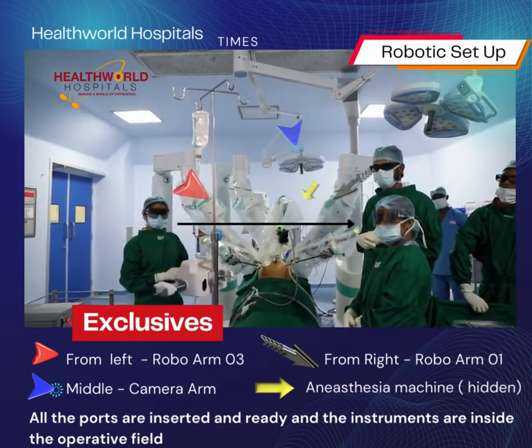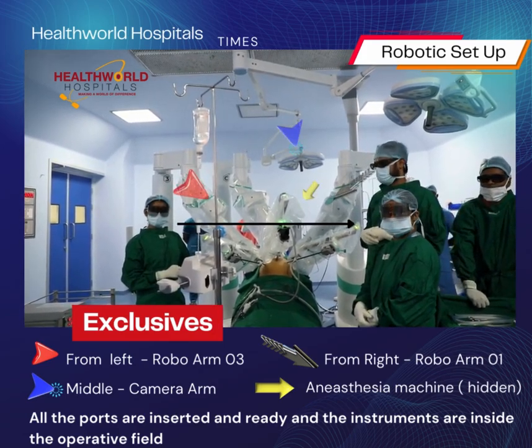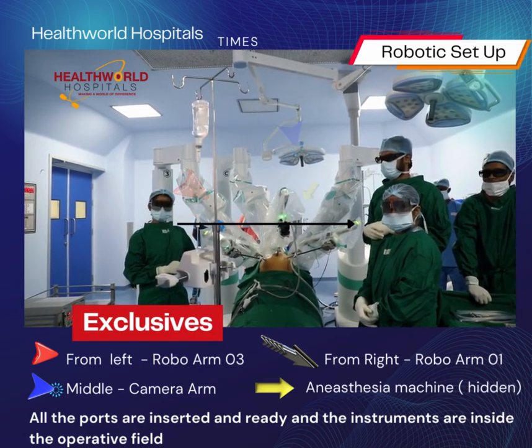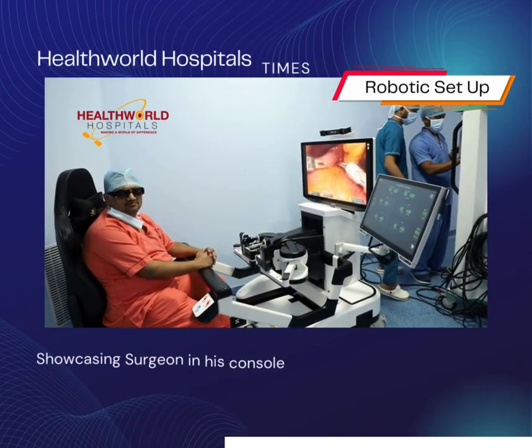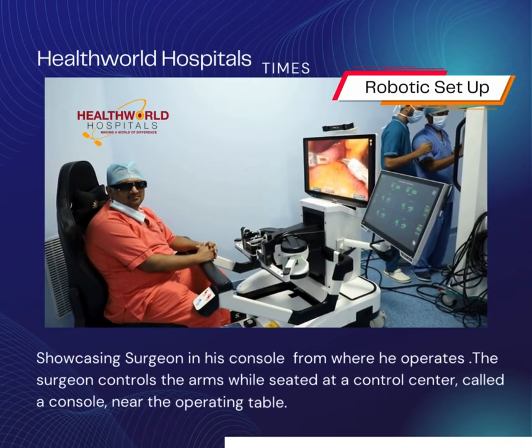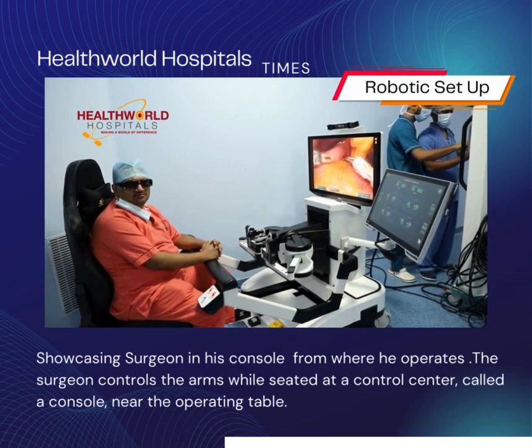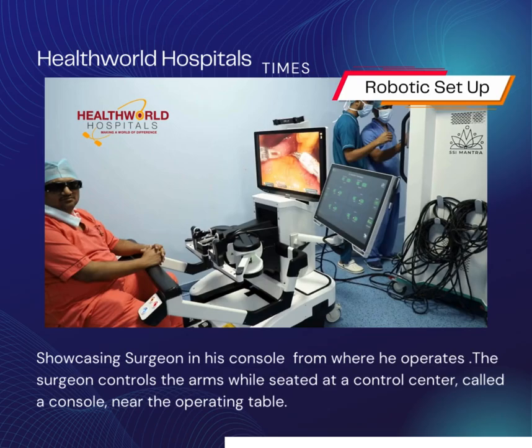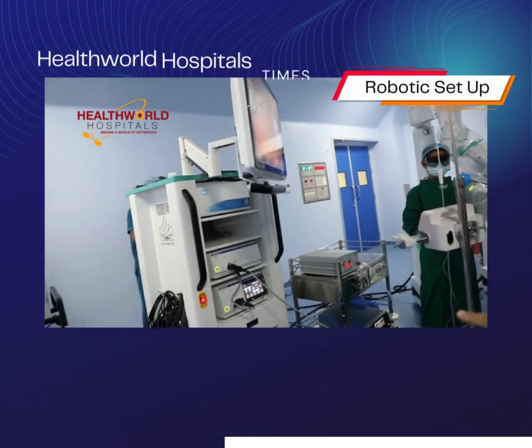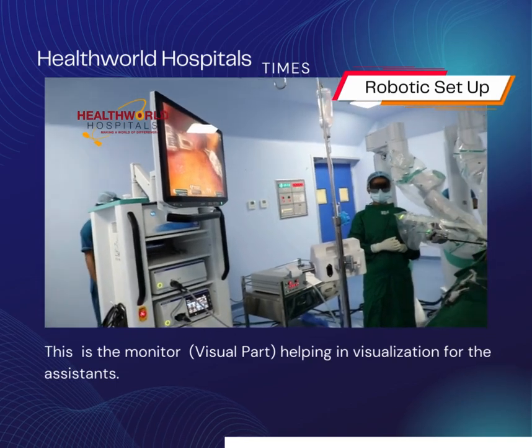This is the whole robotic setup — all the ports are inserted and instruments are inside the operating field. This is the surgeon's console; the surgeon will operate from here. This is the vision card for all the assistants.